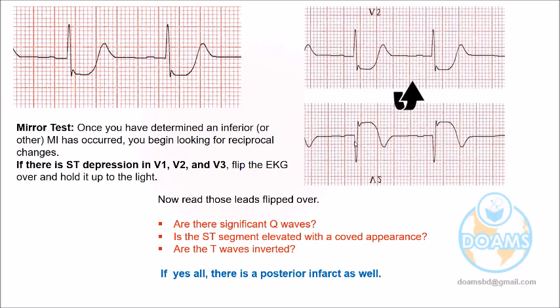After making this upside down, is it not Q? This is Q. This is one. Q, right? This is Q. And is it ST elevation? ST elevation, right? And the appearance is typical, curved up like a cap. And this one, ST depression. Sorry, T inversion. T inversion.